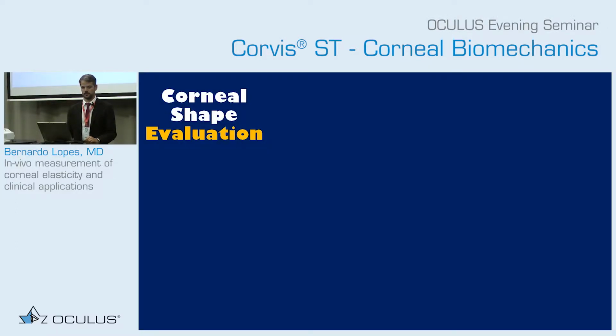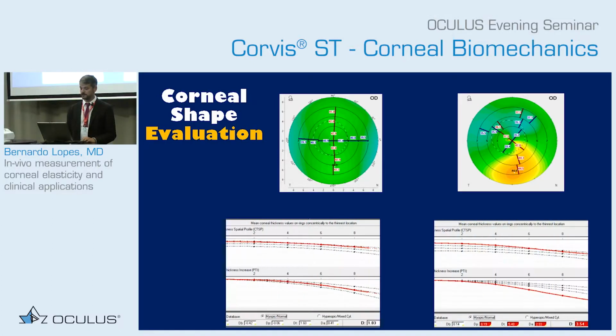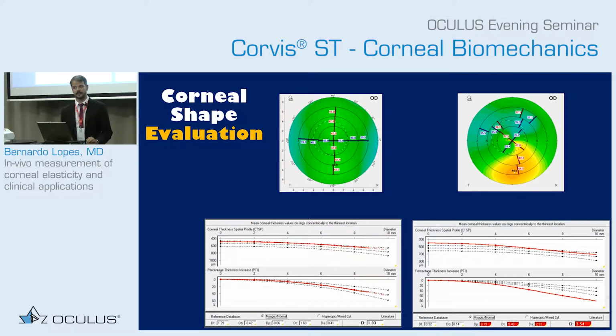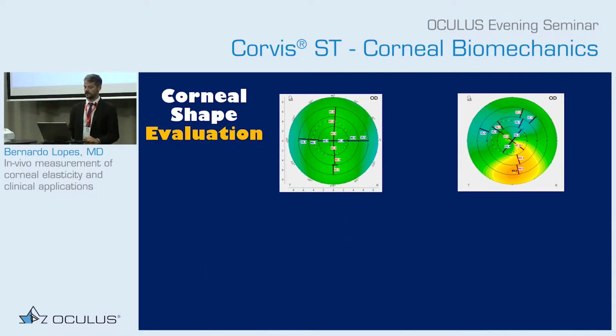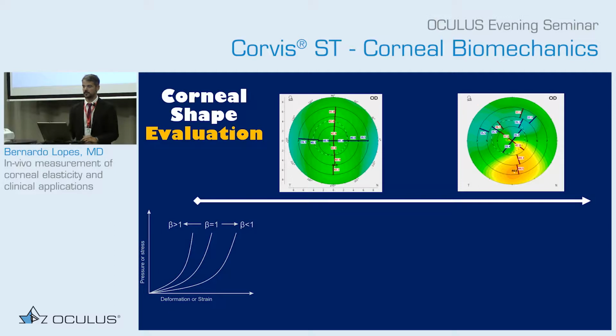As clinicians, we are really used to evaluating corneal shape. We know how to separate a normal pattern from a disease pattern, and we also have objective indexes to help us. But this is not static, it is dynamic. What is normal can become abnormal with time. As Renato always says, we need to find this susceptibility before the abnormality happens, and this susceptibility could be the biomechanical weakening.